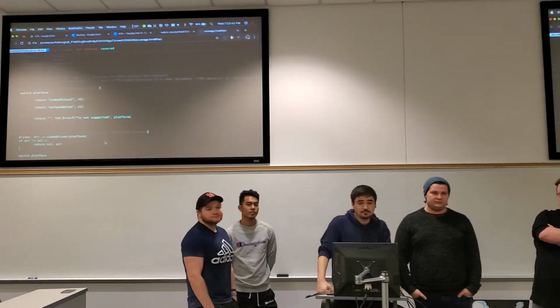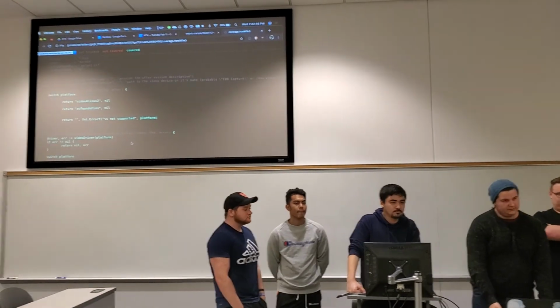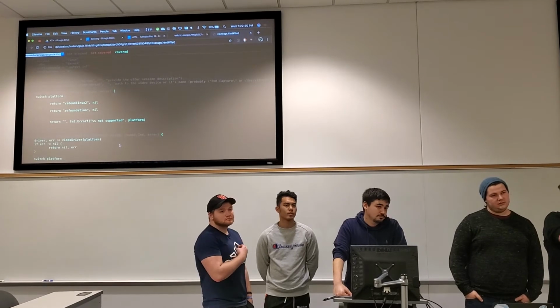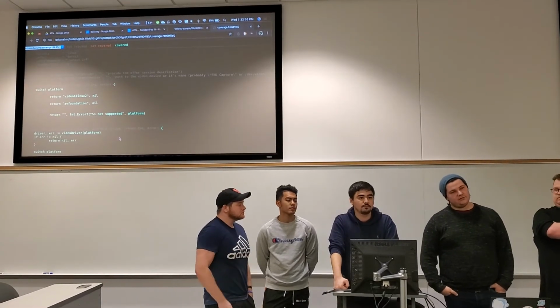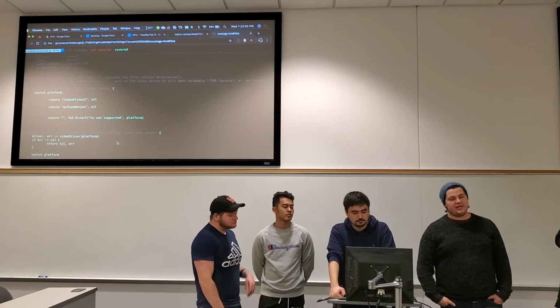Craig, go ahead. I have a question. Whenever you're connected via HDMI, is the same data that's passing from your computer going to be the same thing as when they're plugged into the medical monitor? Well, it just comes in as a raw video stream over UVC. So we can encode that.